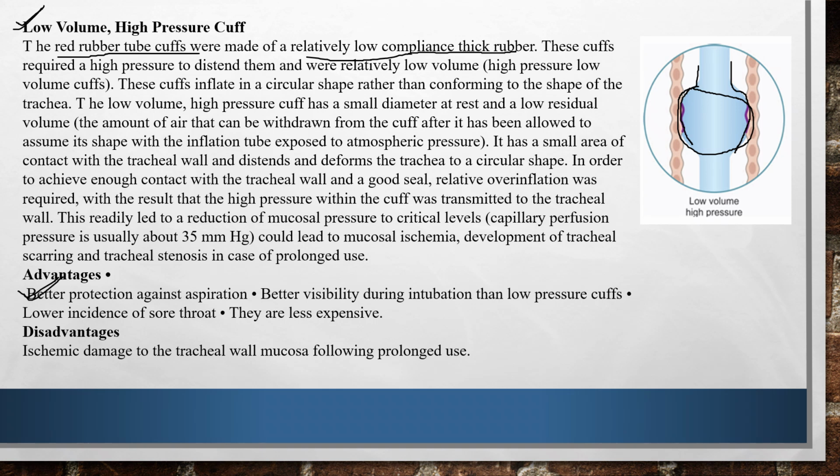It can also increase the visibility during intubation compared to low pressure cuffs or high volume cuffs, it has a lower incidence of sore throat, and it is less expensive.